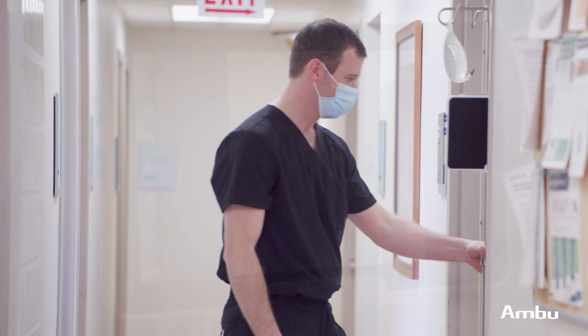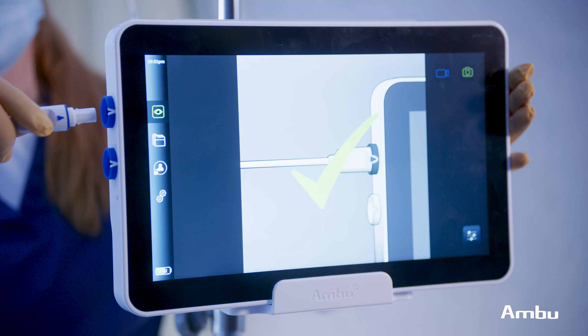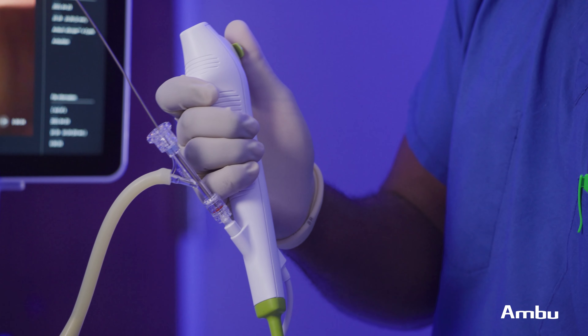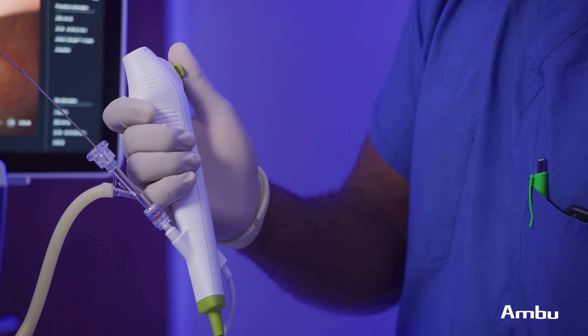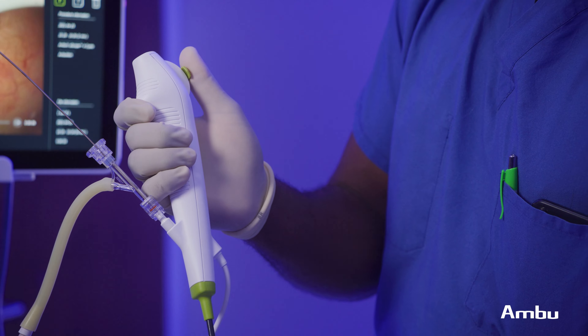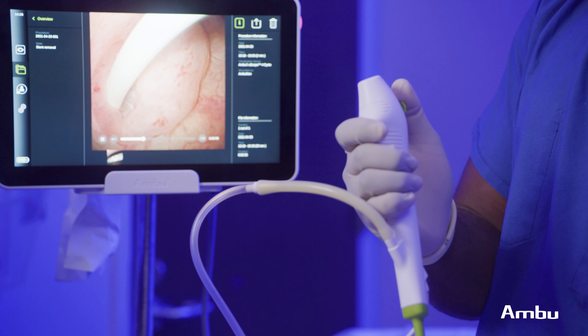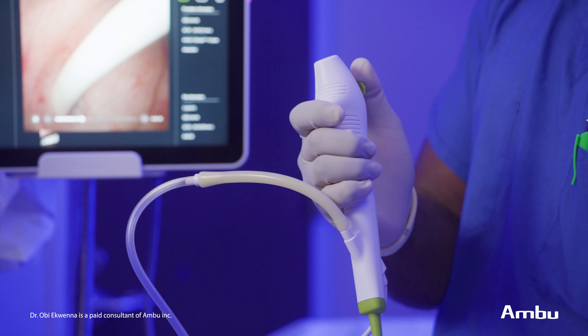Ambu's portable monitor is what makes it very unique. I can sit down and review the results or my findings with a patient and maybe family members and fellow colleagues. In addition, our administrators are happy that we don't have to spend a lot of money repairing scopes. As such, the cost-effectiveness of this scope is well-established at our center.